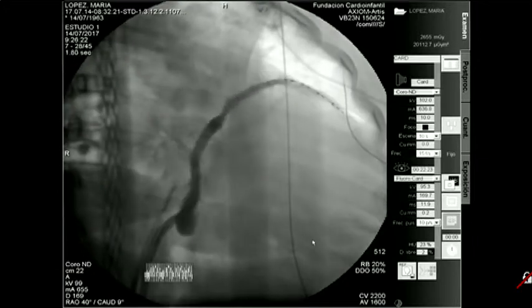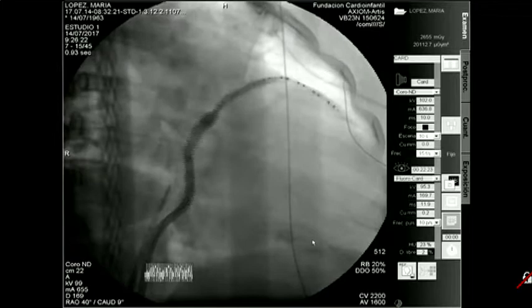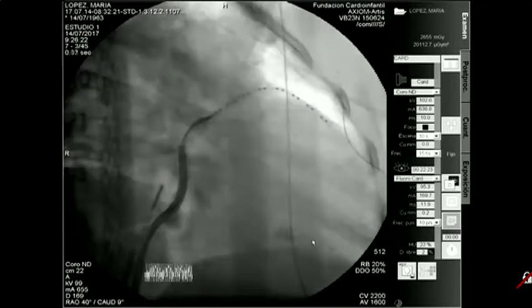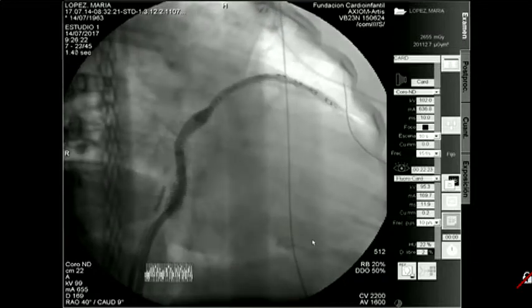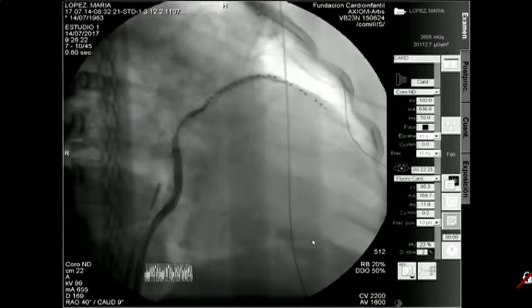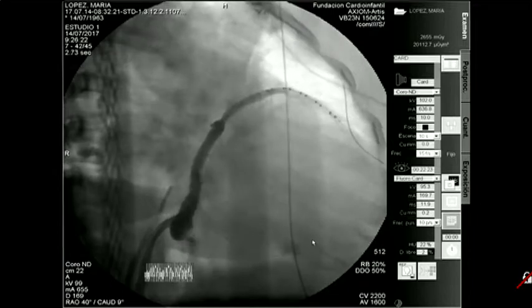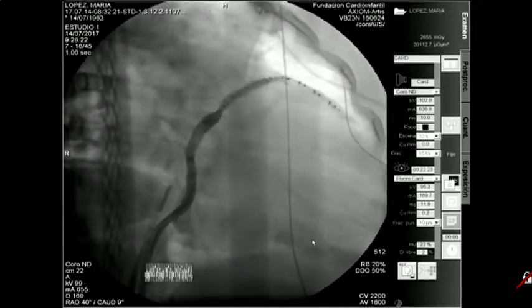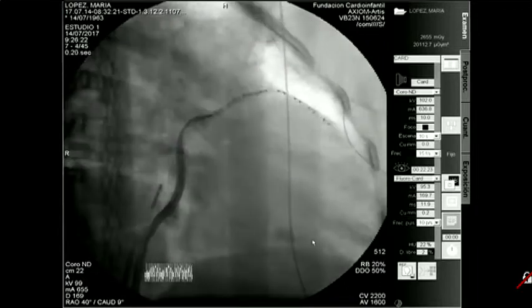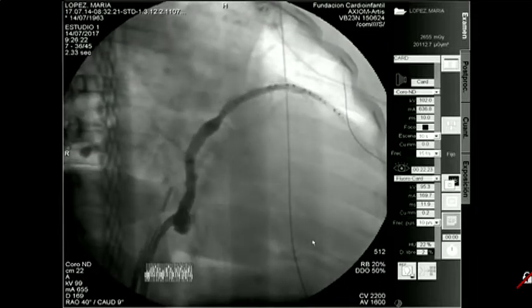We can see the septal. We see the 20-pole catheter in the anterior interventricular vein. We see septal veins. Well, why don't you describe to us, Fermin, the type of catheter you are using, and how can that facilitate the procedure?